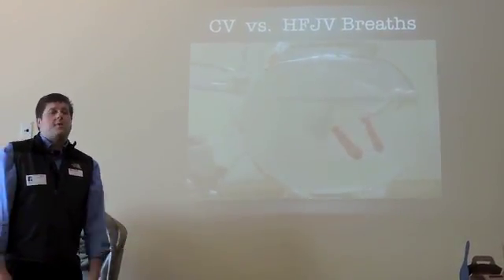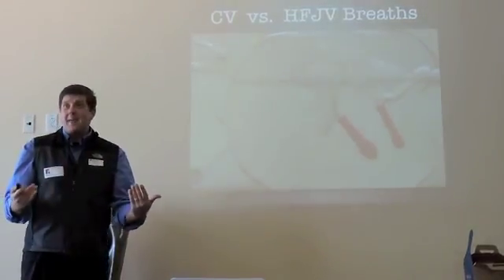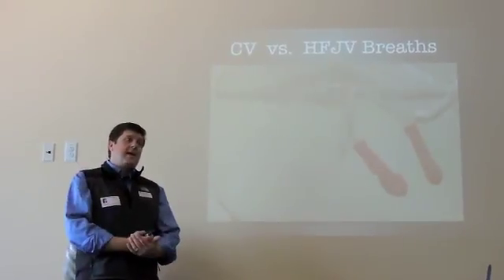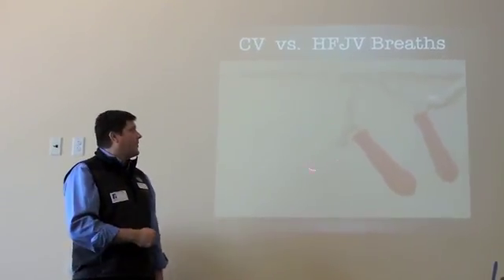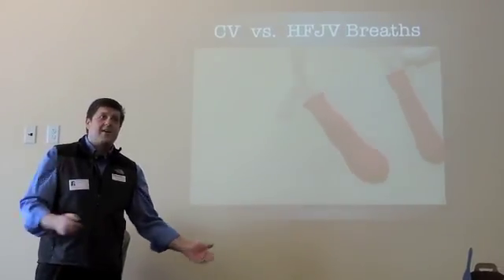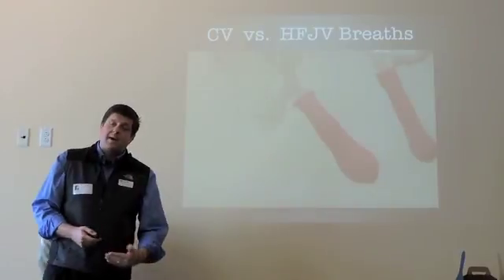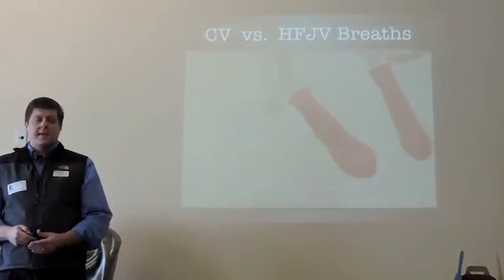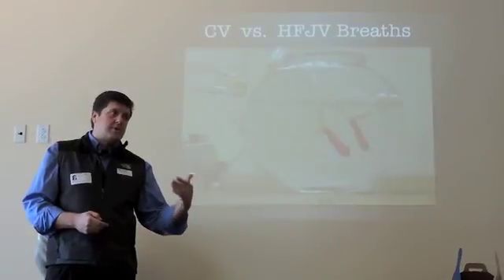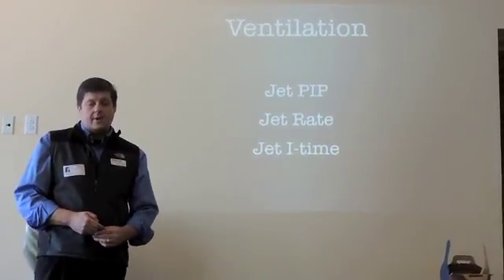But this is also a lesson in why those background sigh breaths can be detrimental. If I have a pneumothorax, and I have chest tubes, and I have PIE, and I'm using the background sigh breaths, where's that gas going? To that injured area, and it's making that area worse. Okay? So that's why it's real important when we're dealing with an air leak situation to be on CPAP, just be on PEEP straight up, and not have any background breaths.